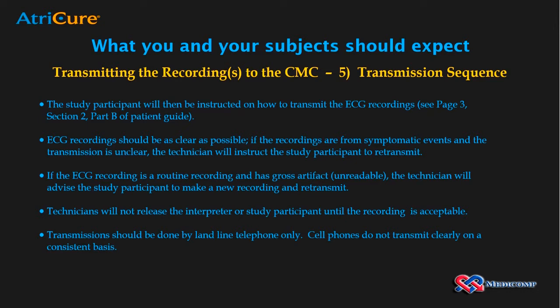Transmissions should be done by landline telephone only, if at all possible, as cell phones do not transmit clearly on a consistent basis. This concludes the segment of what you and your subject should expect. Later on, during the hands-on practice, you'll make a recording, transmit, and clear the monitor so that it is available for your patients to use.